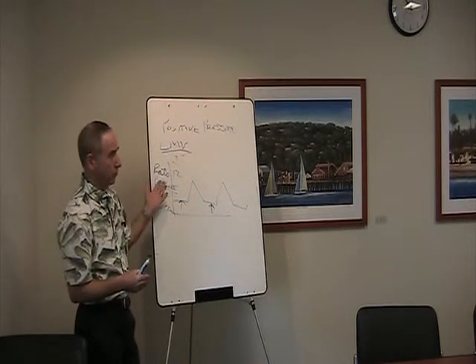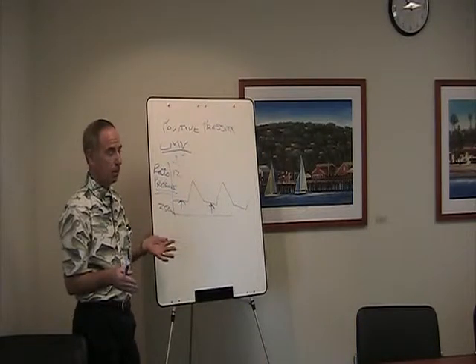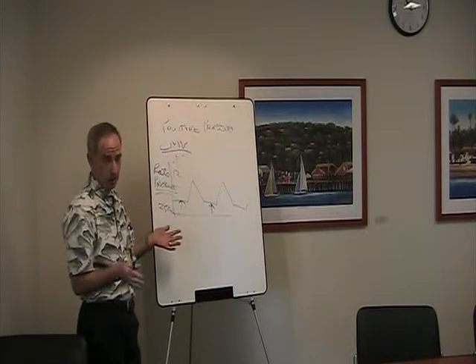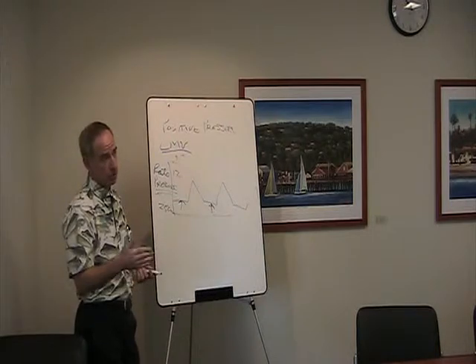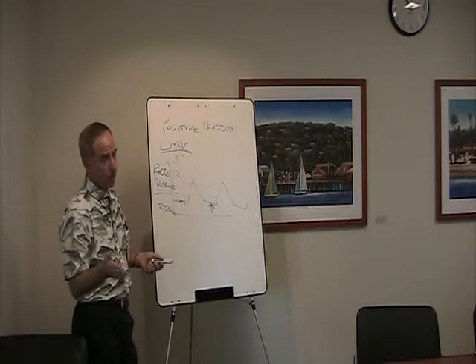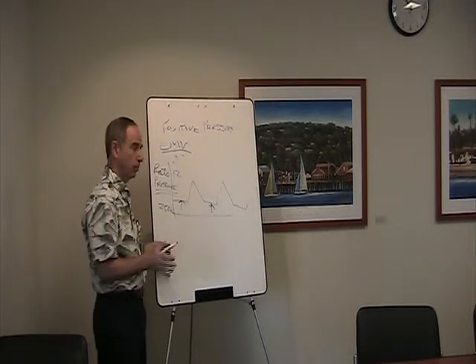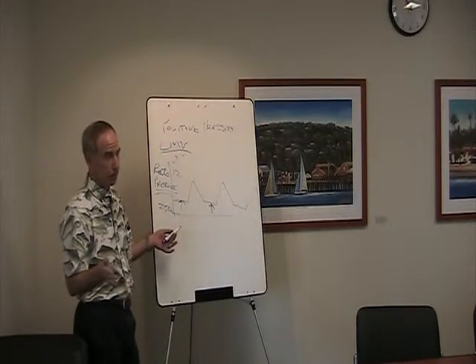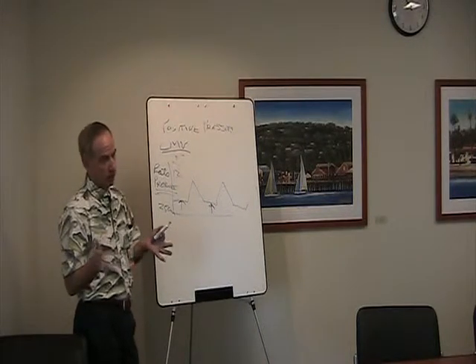So in the operating room in the 40s and 50s, that was not a big deal. Cases weren't usually that complicated. By the time the patient was done with the surgery, they would extubate them, so when they woke up, it wasn't a big problem. But as surgeries became more and more complicated, not everybody could be extubated right after the case. So they needed a way to ventilate people for a more prolonged period of time that was more acceptable to an awake patient.